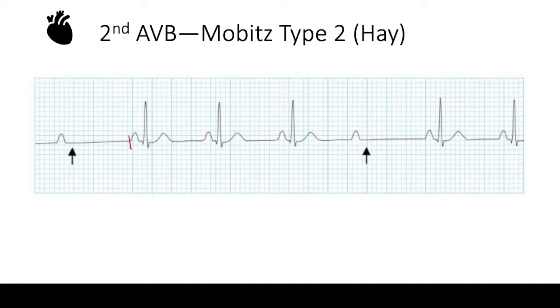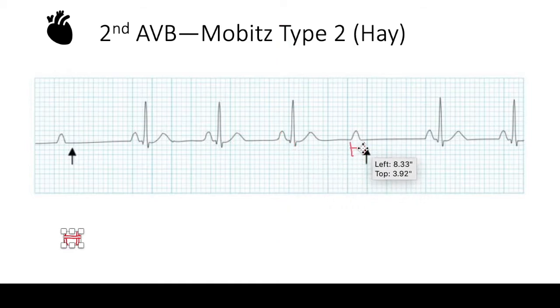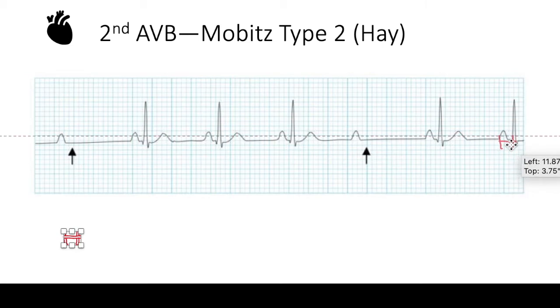Looking at this rhythm strip, the PR interval in each beat is the same — first beat, second, third — and then you have the dropped beat. Measuring the QRS complexes shows the same regularity. This is the quick way to determine type one versus type two: measure the PR intervals and QRS complexes, and you'll immediately know which type you're dealing with.